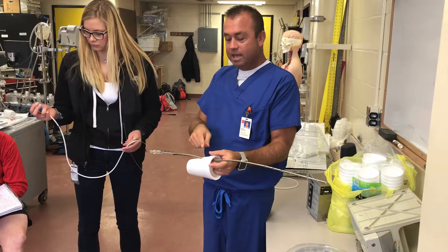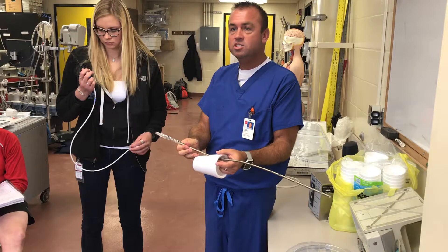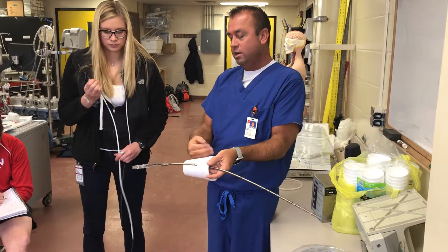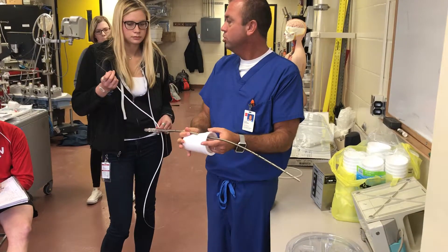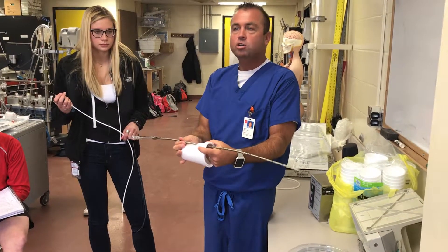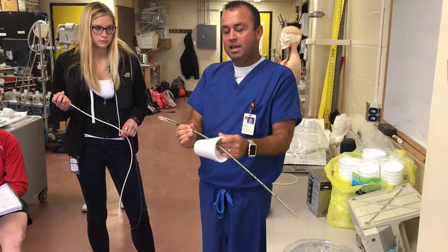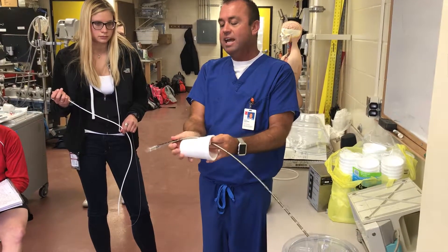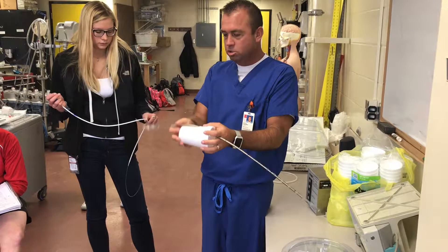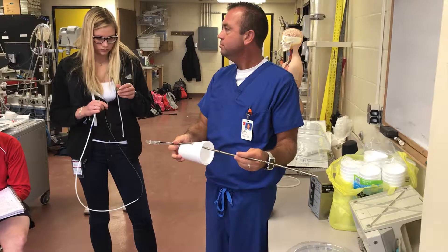That was percutaneous cannulation using the Seldinger technique. Tomorrow you guys are going to practice this — you can go anywhere you want around the cup, and we have several different cups. You'll practice in groups of two or three. Once you have that cannula all the way in, they'll tack it down along the leg using a suture — almost a purse-string suture — so that the cannula stays in place down the lumen of the vessel.